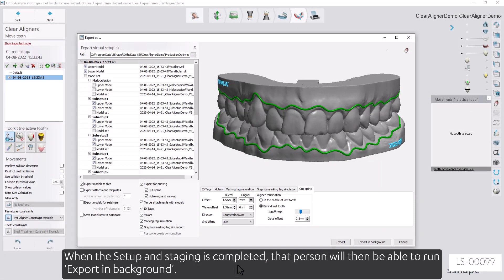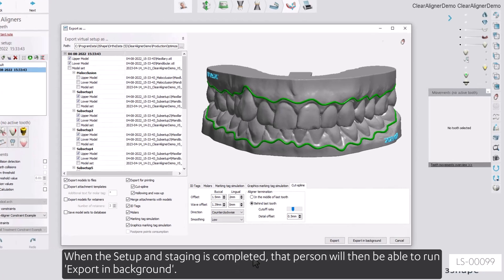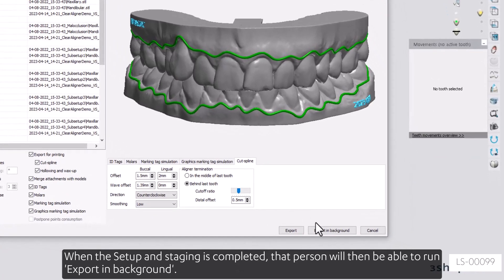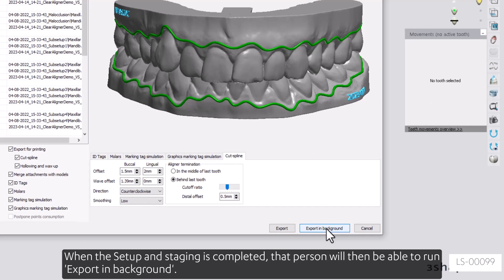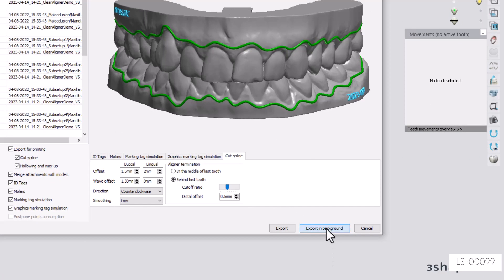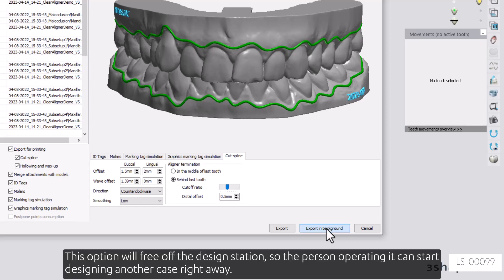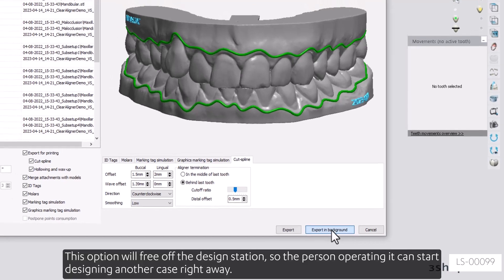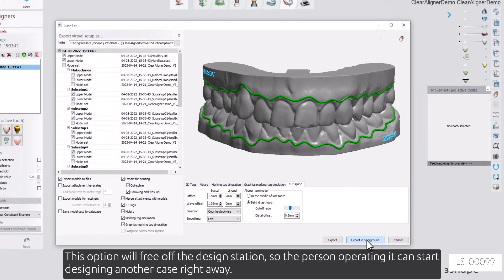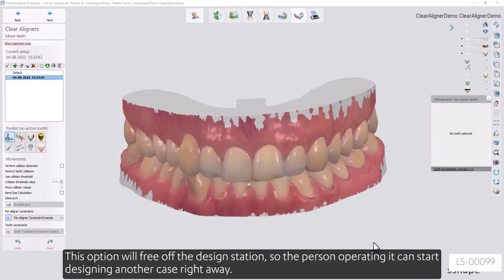When the setup and staging is completed, that person will then be able to run export in background. This option will free off the design station so that the person operating it can start designing another case right away.